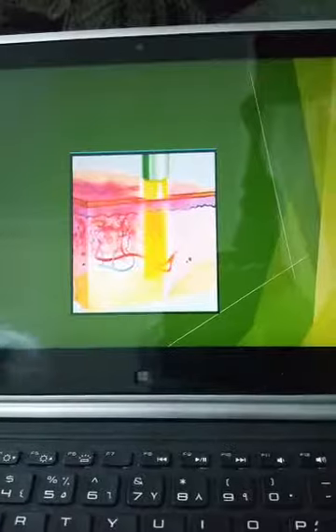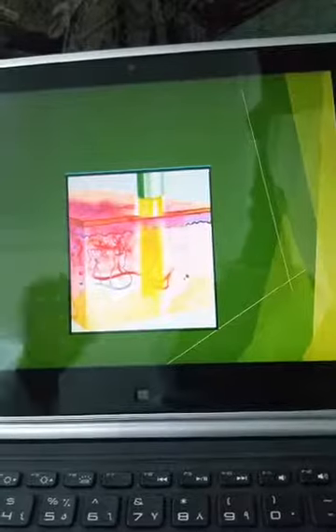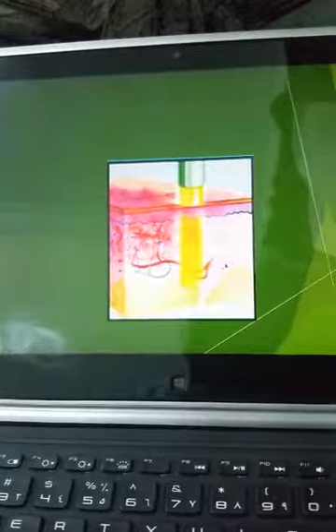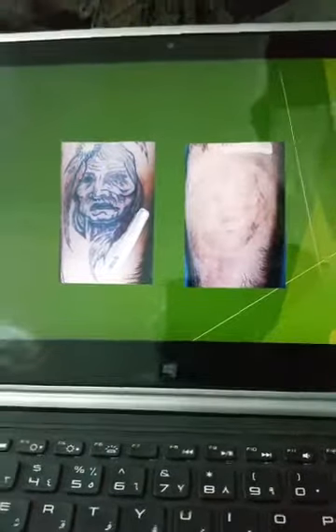So if I am doing a surgery, for example a frenectomy using diode or Nd:YAG, I have to be very careful about the epidermis and the blood vessels supplying the anterior teeth. I might damage them without noticing any changes in front of me. So in this case, I have to be careful in the direction of my light and also the power of my light and the type of wavelength I'm going to use. We could see here, I might seal the blood vessels deep here without too much change in the surface. So for different types of colors, I have to select different types of laser.